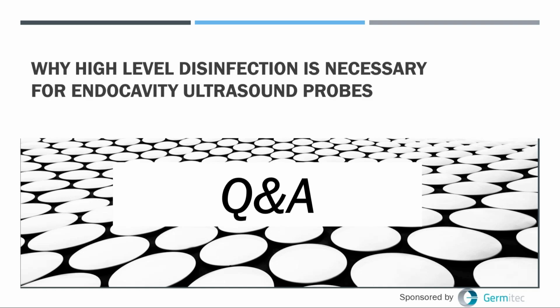That's why when you look at, say, an automatic endoscope reprocessor for an ERCP scope that automatically cleans and disinfects an ERCP or a duodenoscope, you find lower risks for contamination, as opposed to having a human do all the manual cleaning and the manual chemical disinfection. If they did the cleaning and disinfection 100% of the time, it would work.